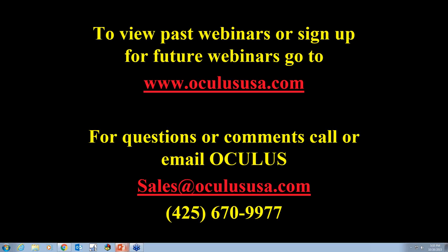The first question is, when comparing two posterior elevation maps, pre and post LASIK, for ectasia, do you recommend changing the best fit sphere reference number? Yeah. So both maps are using the same best fit sphere radius? Okay. Very, very good question. If you're doing a study, or if you're going to be publishing a paper, the answer is yes. And most people don't know how to do that.